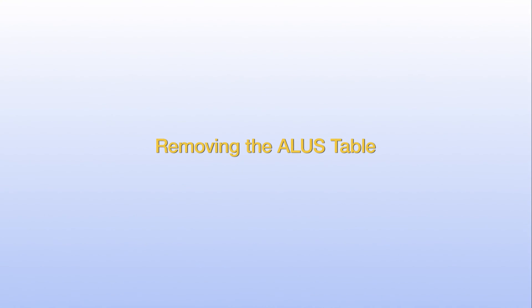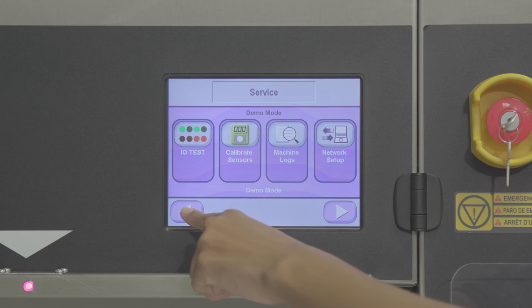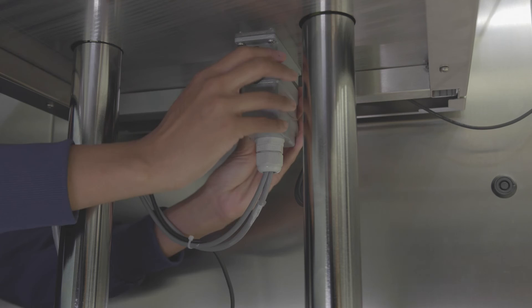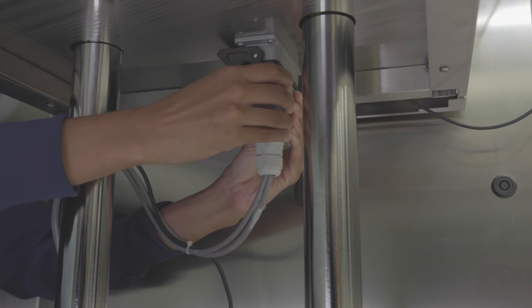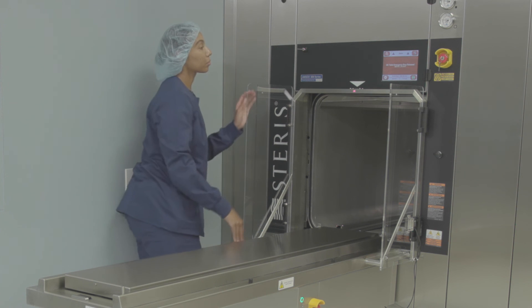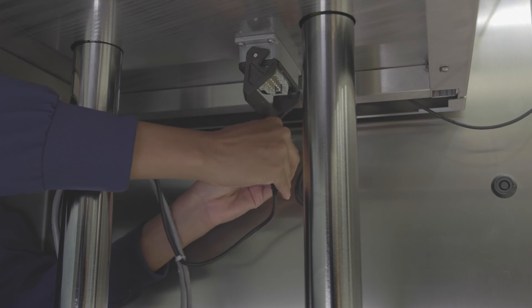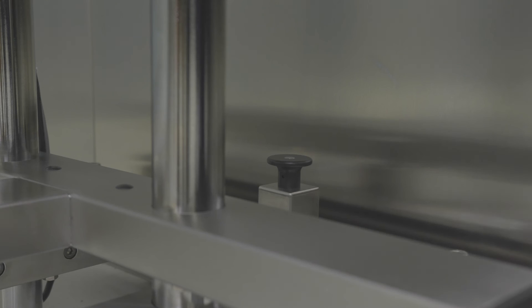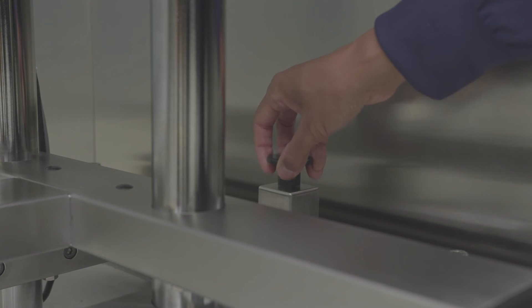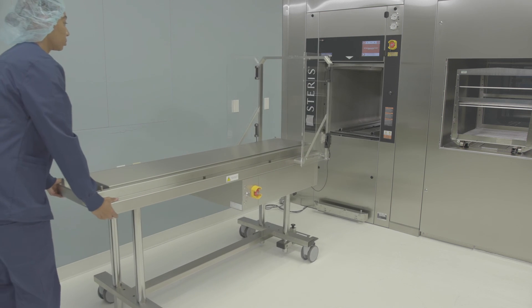You may need to remove the ALUS loading table from the front of the sterilizer if the chamber needs to be cleaned or if repairs are needed. First, open the chamber door, then put the sterilizer in standby mode. Disconnect the ALUS cable from underneath the table — the sterilizer will alarm when the ALUS disconnects, so silence the alarm. If the ALUS has a barcode scanner, disconnect the scanner cable underneath the front of the table. Unlock the casters. Pull the lock pin handle on the docking station upward to disengage the lock from the docking plate, then roll the ALUS table away from the sterilizer.